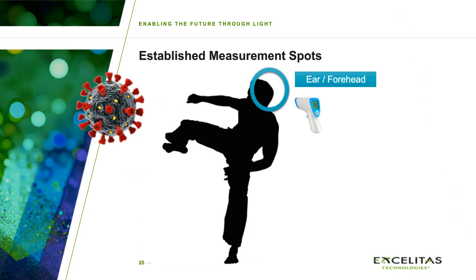And those devices are so long just because there is a very long tube inside reducing the stray light, and the sensor is just sitting at the very end, just behind this display. Those are the pyrometers. So this would be such a device which shows you a quite low distance dependence.